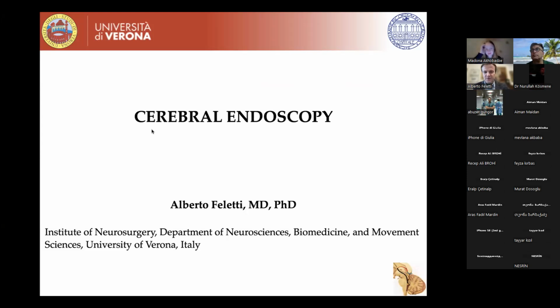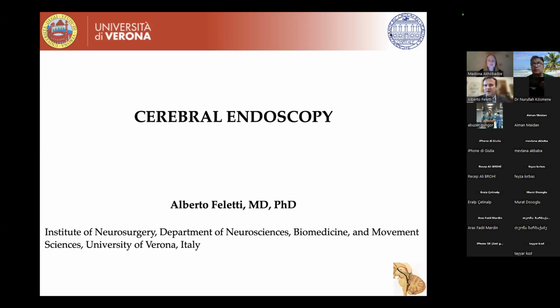Okay, great. So the topic I was asked to talk about is cerebral endoscopy, which is actually a very, very large field. So it was kind of a difficult task for me to summarize somehow not only what I do about cerebral endoscopy, but what can be done in general.